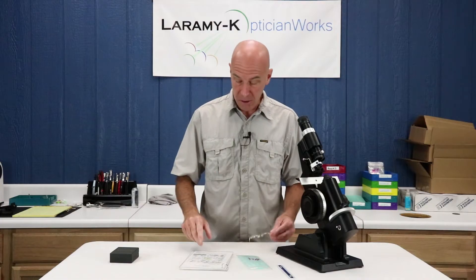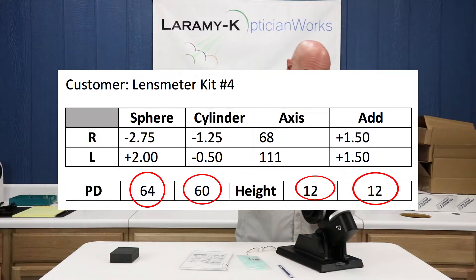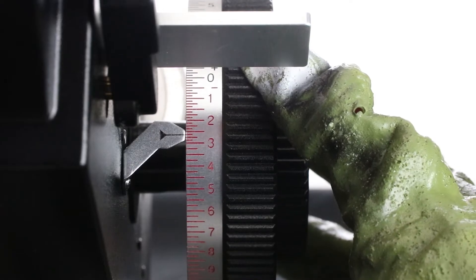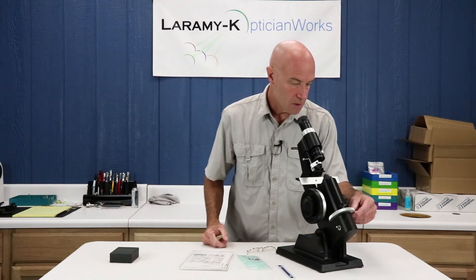We're not going to do anything different from what we've been doing. Our right is supposed to be a minus 2.75, minus 1.25 at 68. I can turn my lens meter on, turn my power drum to minus 2.75, and turn my axis wheel to 68.